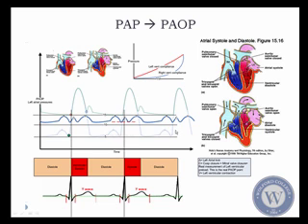The next point is the PA occlusion pressure. Eventually the catheter goes in here and the balloon is inflated inside the pulmonary artery. What we're looking at when we're looking at a PA occlusion pressure is really the left atrial pressures. So as a consequence, when you put the balloon up, the actual PA occlusion pressure has to fall below the PAD.